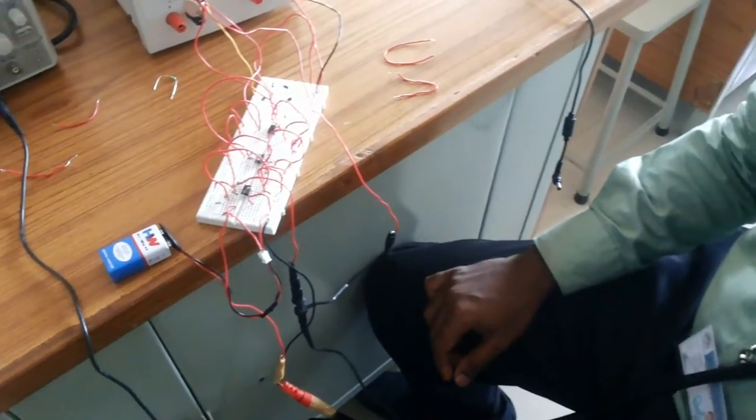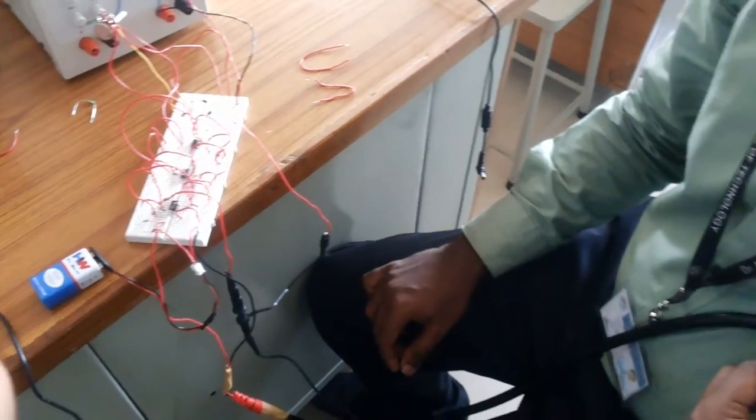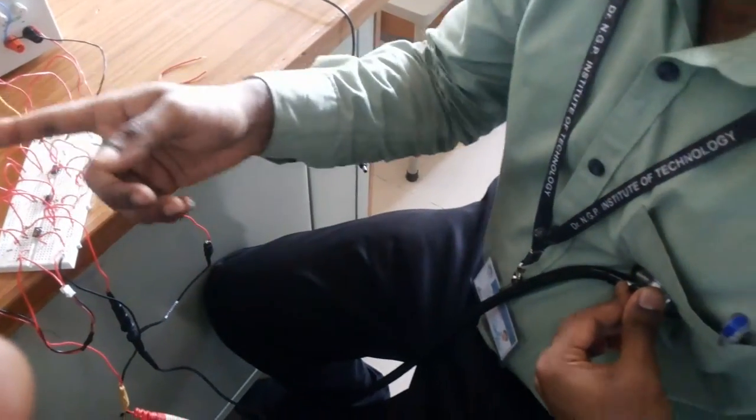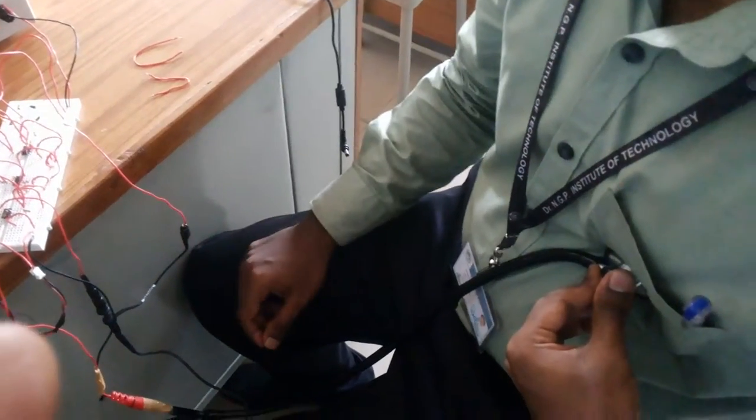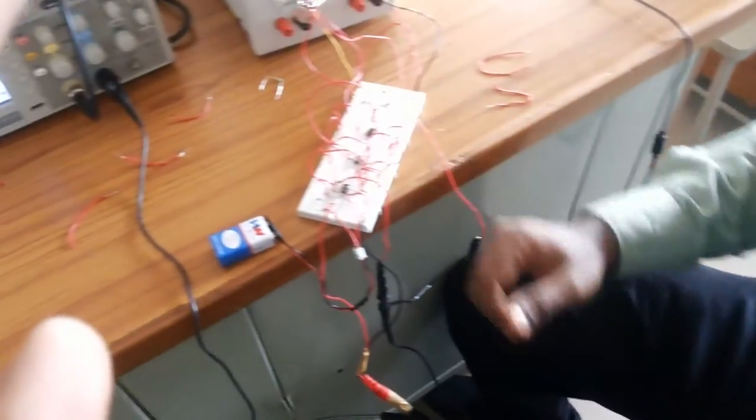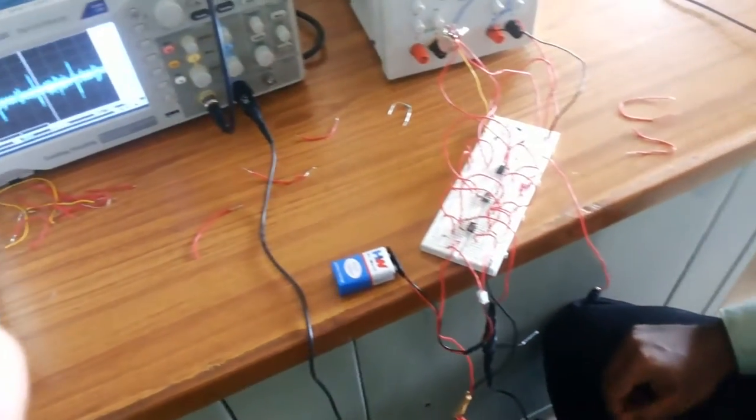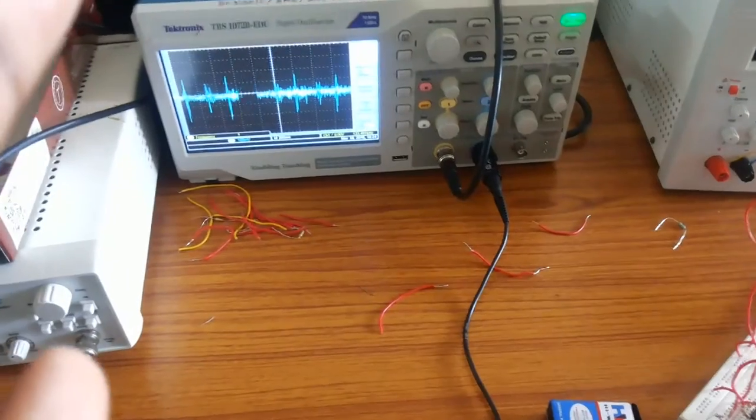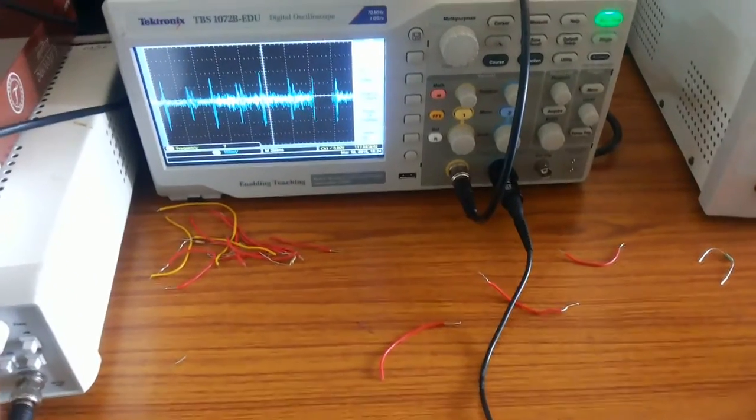Initially, we took a stethoscope and interfaced it along with a calibrated microphone on one end. It plays the role of converting sound energy to electrical energy, which is the basic principle behind this project.